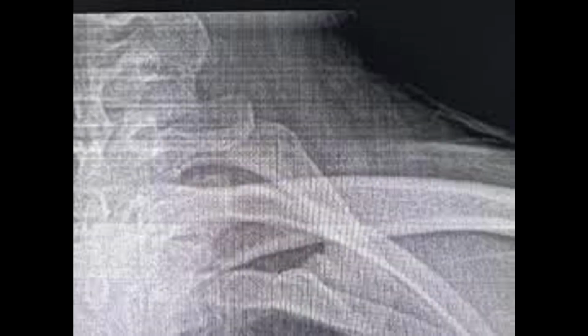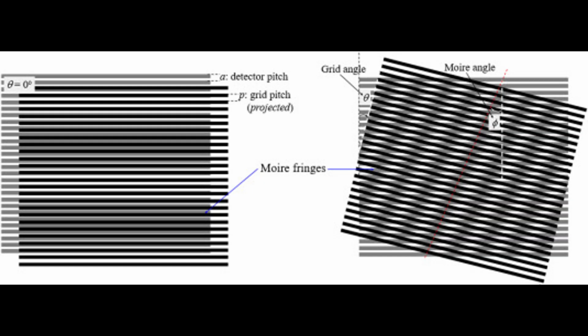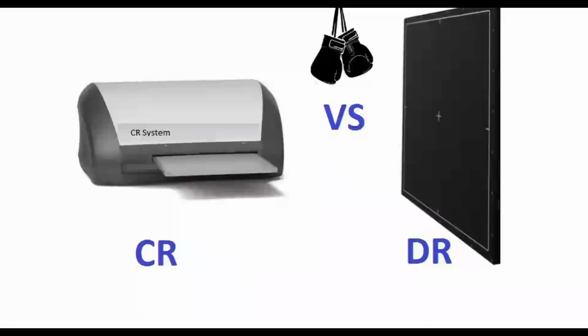In summary, the grid is essential for thick body areas, and proper use increases contrast, but unnecessary use only increases patient dose. Therefore, knowing the grid type and maintaining correct distance and alignment is very important. 8.